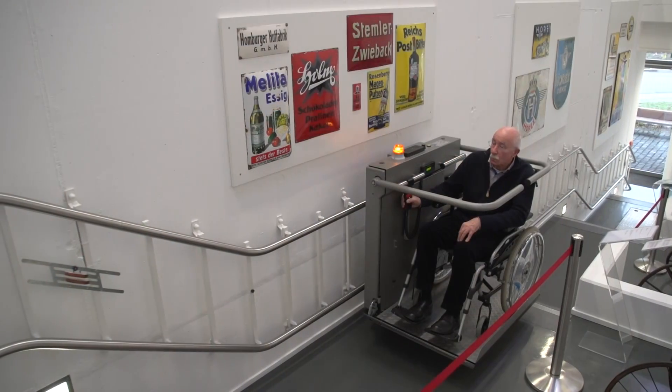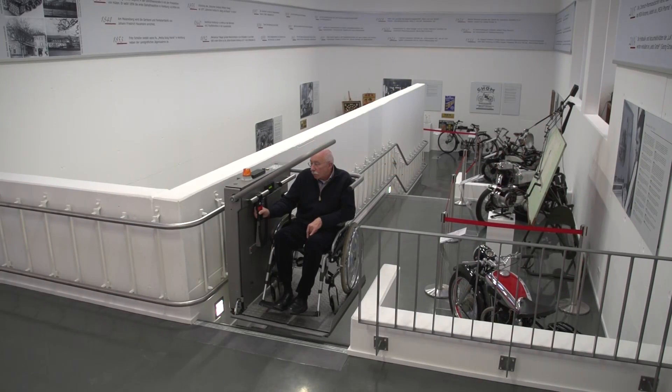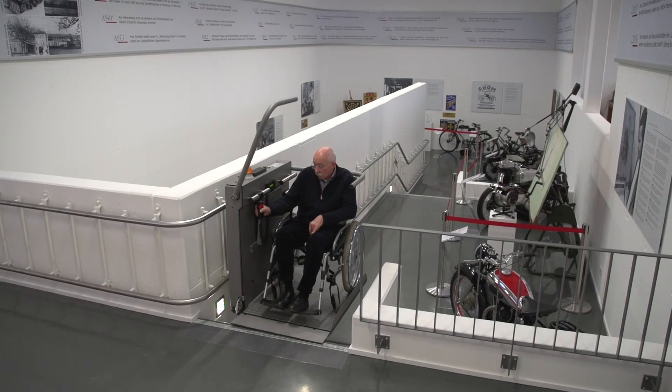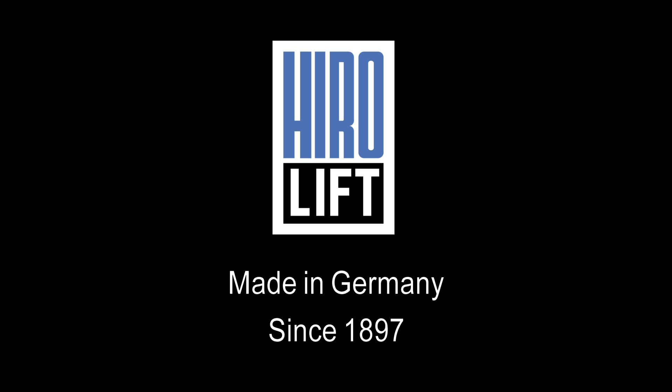Typically it takes only a few rides to become familiar with the operation of the lift, for permanent access to all floors. Hero lift — made in Germany since 1897.